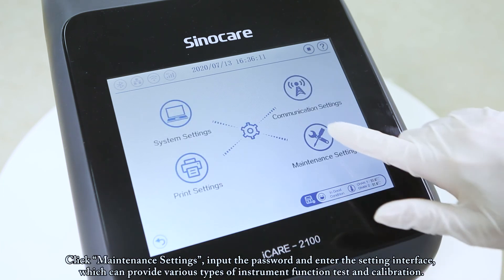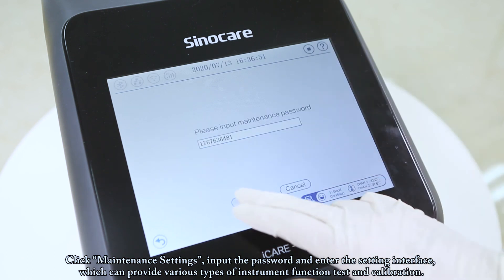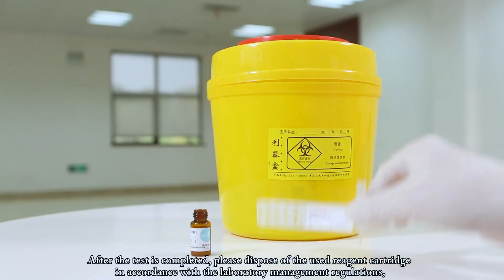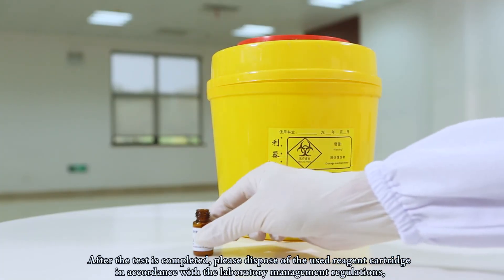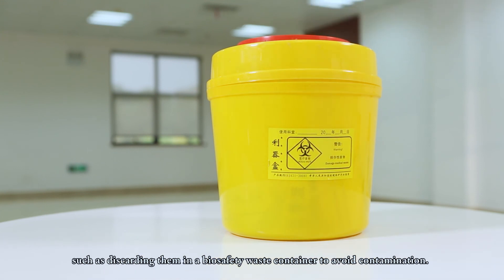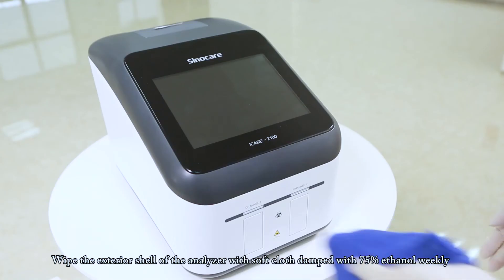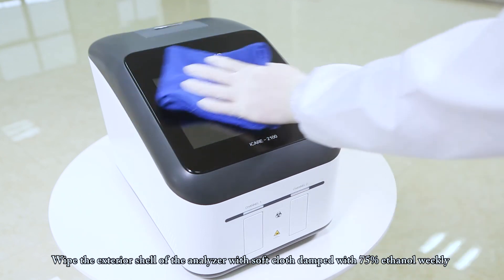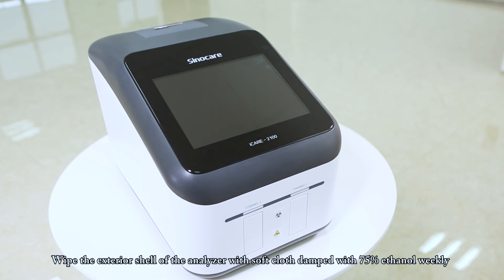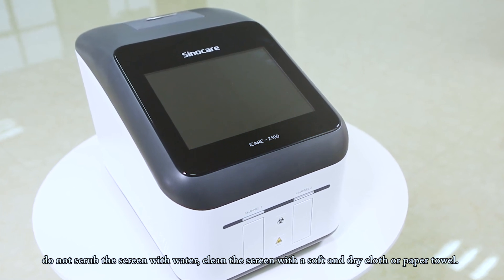Click Maintenance Settings, input the password, and enter the interface, which provides various types of instrument function tests and calibration. After the test is completed, please dispose of used reagent cartridges in accordance with laboratory management regulations, such as discarding them in a biosafety waste container to avoid contamination. Wipe the exterior shell of the analyzer with a soft cloth dampened with 75% ethanol weekly. Do not scrub the screen with water — clean it with a soft dry cloth or paper towel.